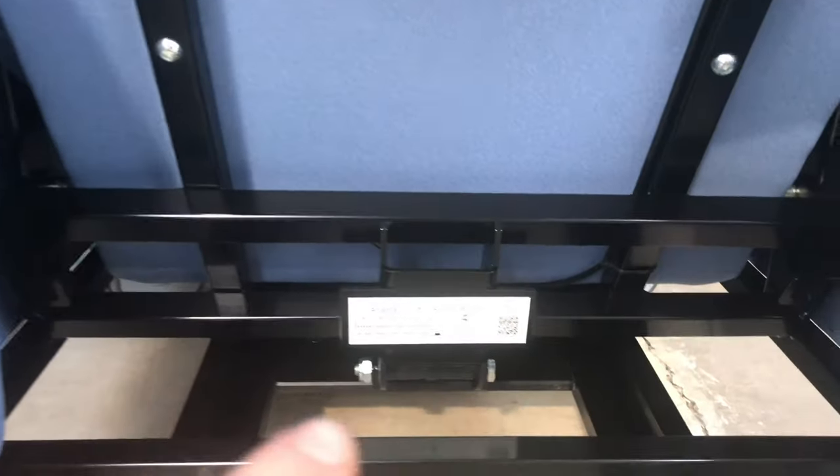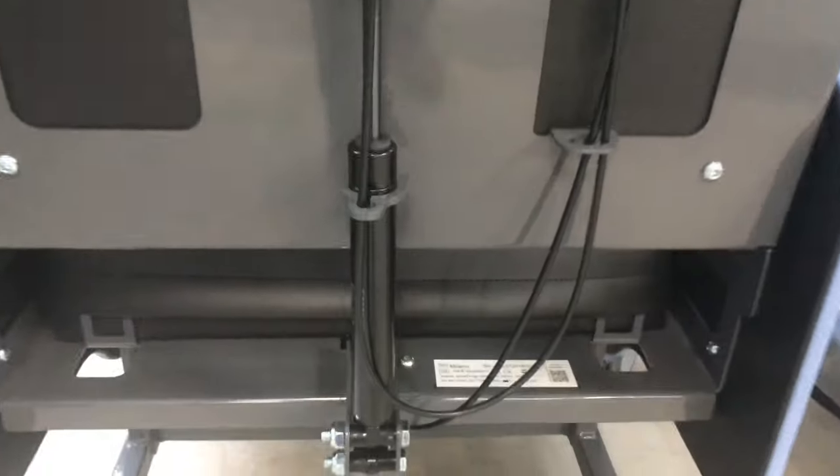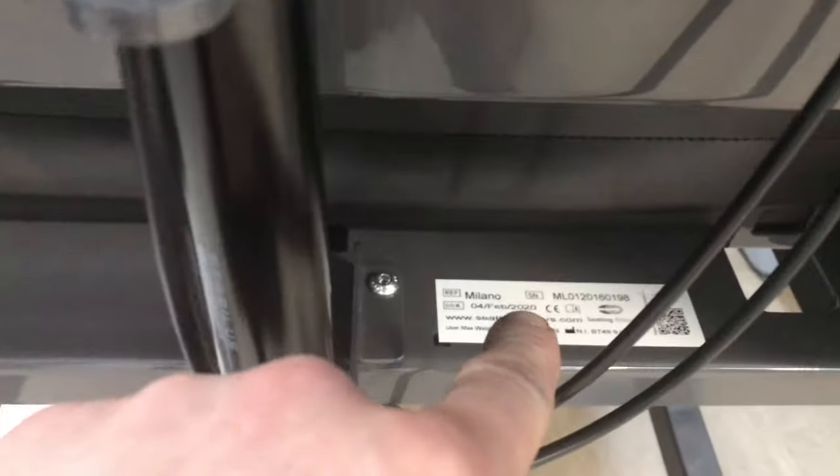On the Atlanta chair it is the exact same — at the bottom of the back. On the Milano chair it is in the same location, to the right-hand side of the back.